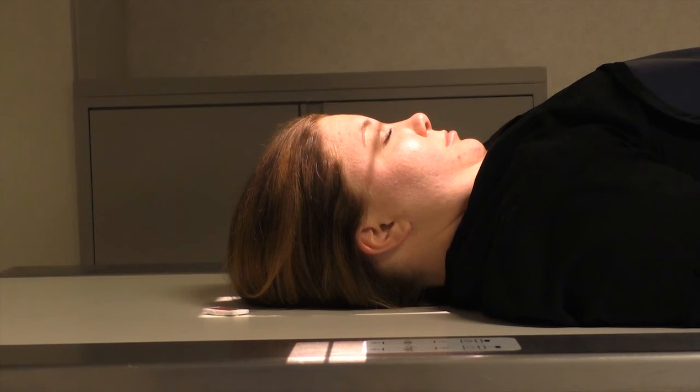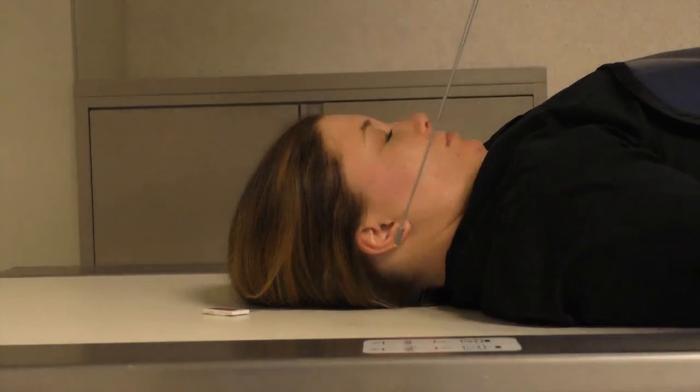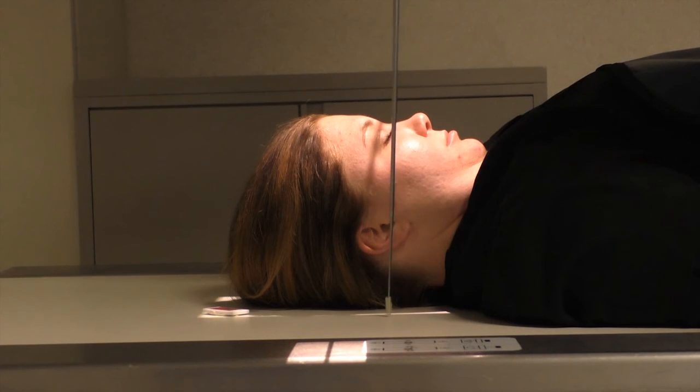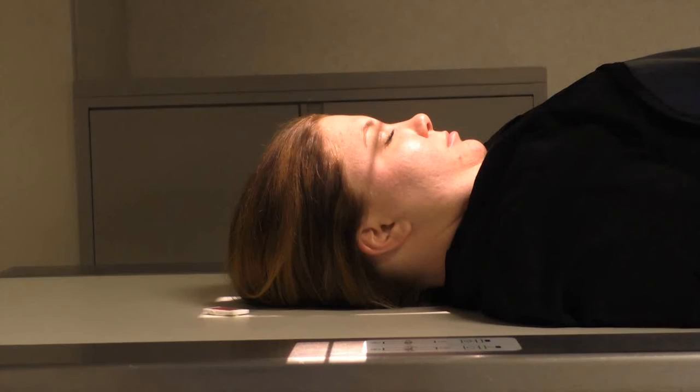For the reverse Caldwell method, there is a 15-degree cephalic tube angle to the OML. The mid-sagittal plane is perpendicular to the IR. The OML is perpendicular to the IR, avoiding any tilt or rotation. Center at the nasion, collimate around the area of interest. Marker is placed on the correct anatomical side. Suspend respiration.